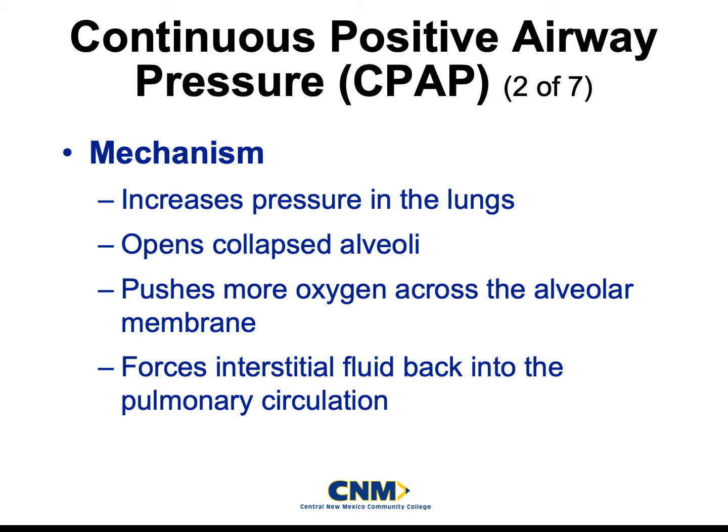So we want to make sure that we're getting a good SAMPLE history, trying to get as many questions as we can out of our patient before we put this machine on. But if we can't do it and we need to throw this machine on right away, let's do that. We can ask questions later, right? Because really when it comes down to it, it's all about airway, breathing, and circulation.